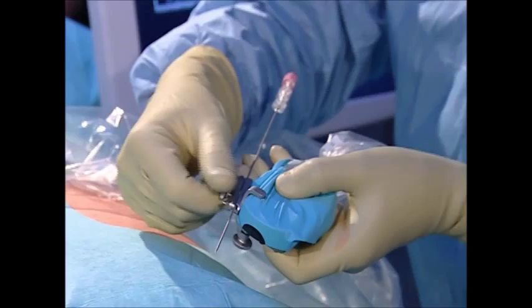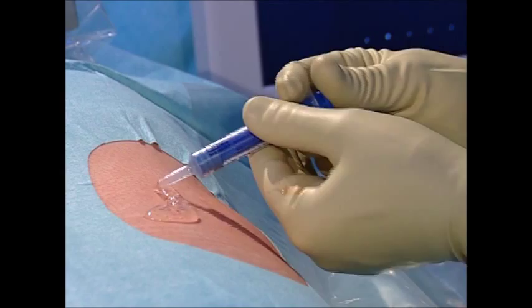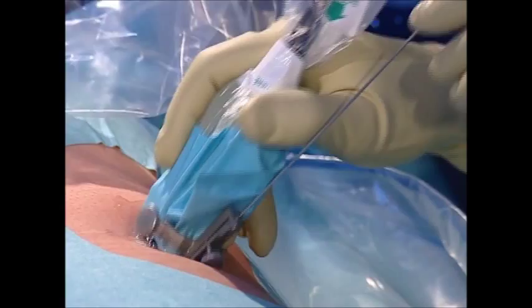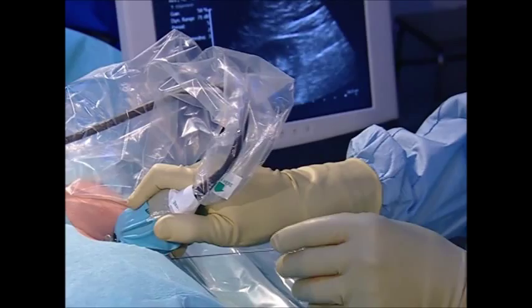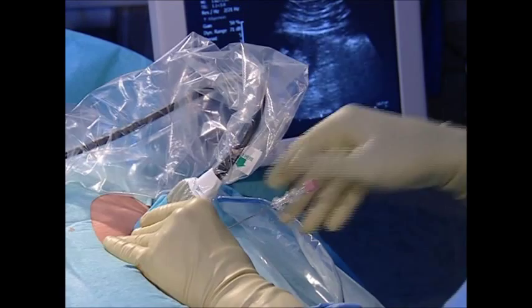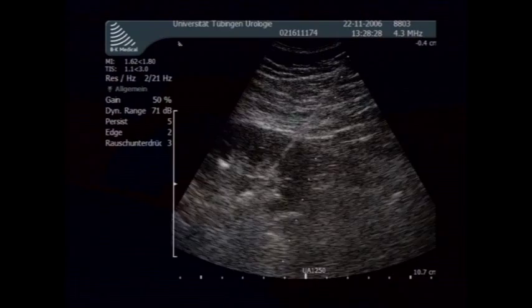After applying ultrasound contact gel, the puncture is performed through the papillae of the posterior calyx of the stone-bearing calyceal group. The axial alignment of the access with the calyx should be preferred, minimizing the risk of bleeding by avoiding injury to larger renal vessels. Moreover, ultrasound-guided puncture minimizes injury to adjacent organs.